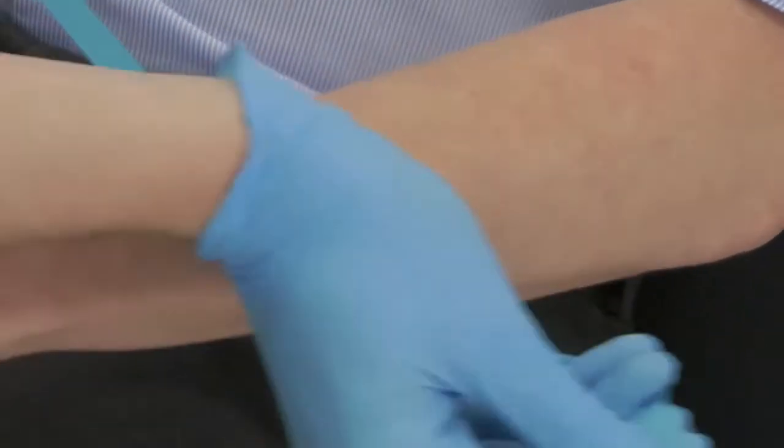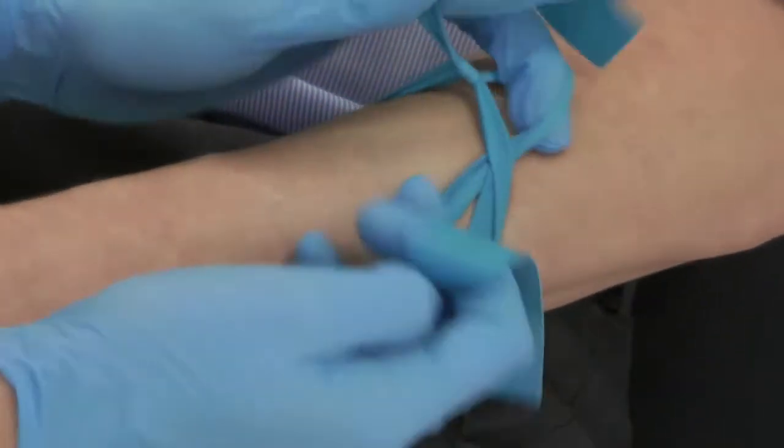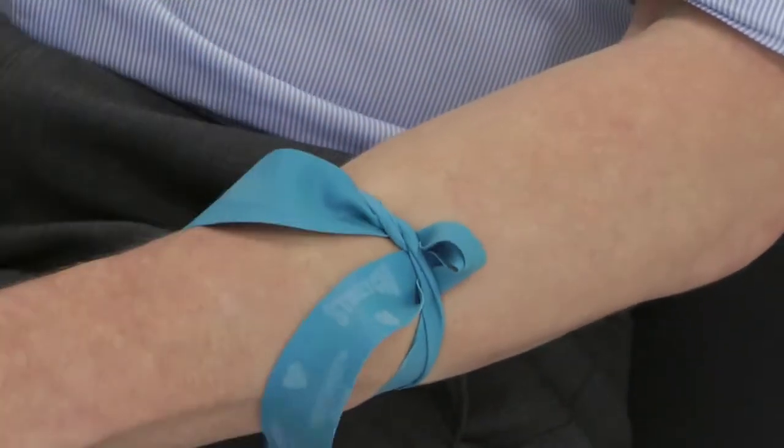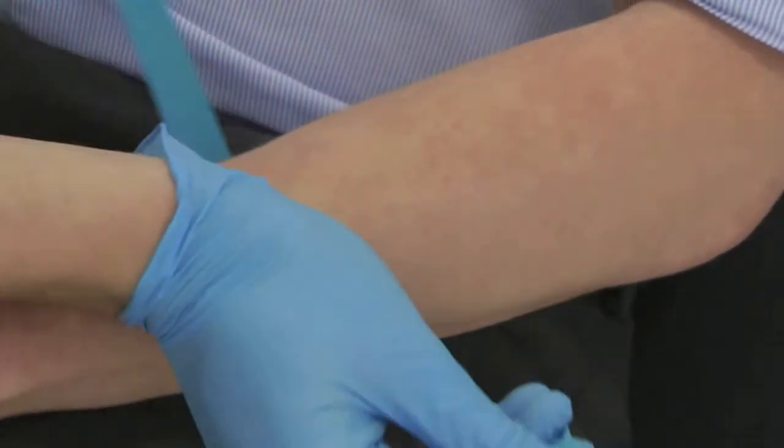Next, the disposable tourniquet. To apply this band you mustn't tie a knot around the arm. This way shown allows for a quick and easy release with one hand. And once again slightly slower. Pull the ends to apply tension. Push the arm down with the heel of your hand so it doesn't rise.